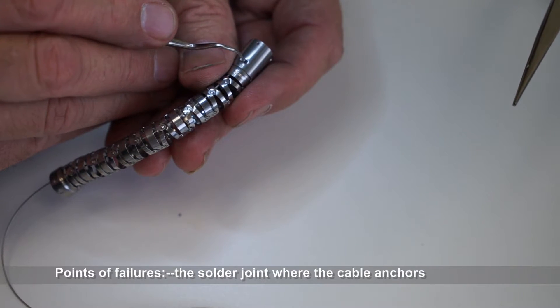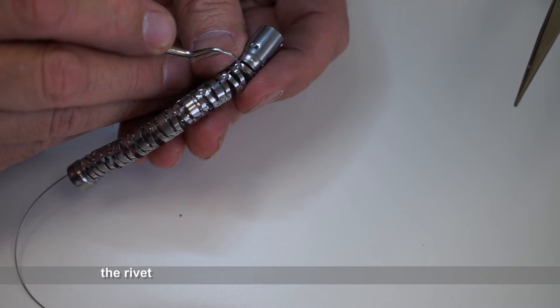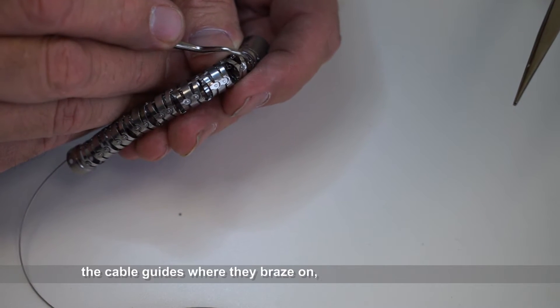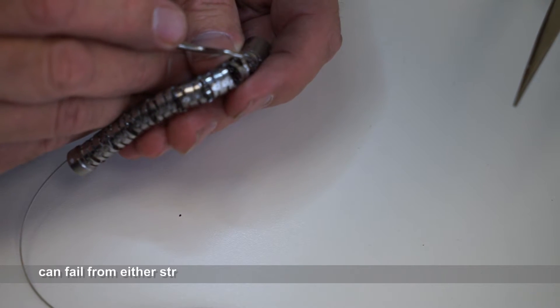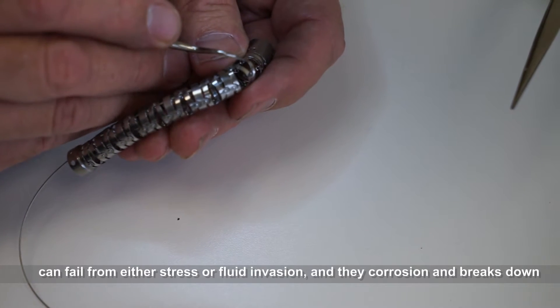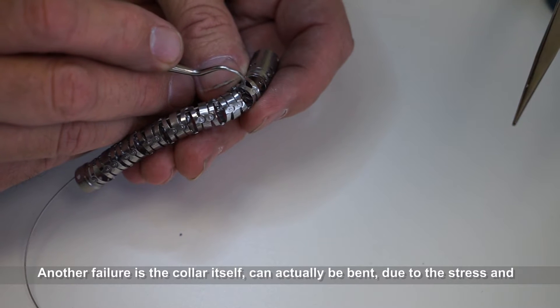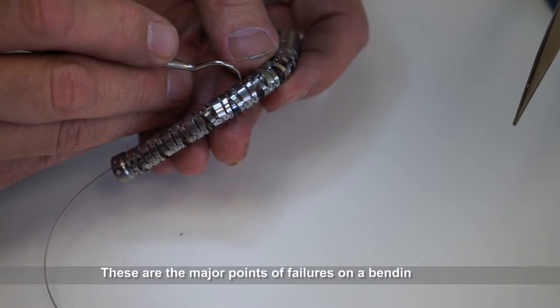Points of failure: the solder joint where the cable anchors, the rivet either internally or externally can fail or be sheared off, the cable guides where they're brazed on — the brazing can fail from either stress or fluid invasion, corrosion, and breakdown. Another failure is the collar itself can actually be bent due to stress and work-over fatigue. These are major points of failure on a bending section.